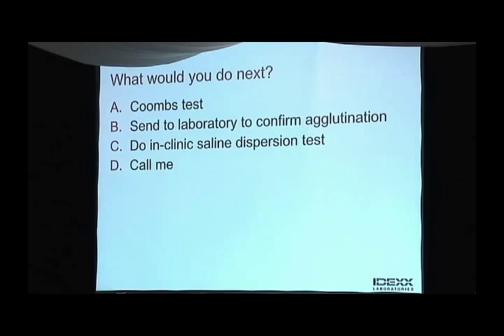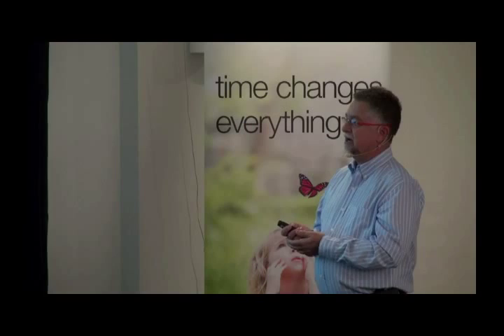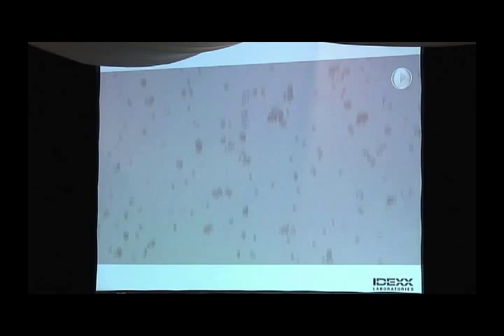So what we're gonna do now is an in-the-clinic saline agglutination test or dispersion test. And Dr. Di Nicola actually gave me these videos, he showed them, and what he does is he puts anticoagulated blood, remember you take it out of the EDTA tube, and he puts a cover slip on top of the blood, and then he shoots saline with a pipette through the side, all right? So he uses one of those droppers, and if there is autoagglutination, the clumps will persist, whereas if there is rouleau formation, they will break up. And as you can see, the clumps do persist, all right?